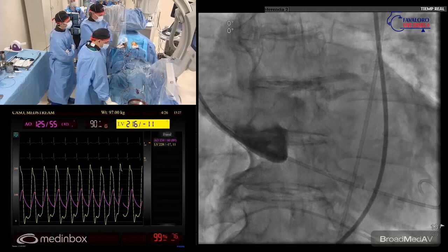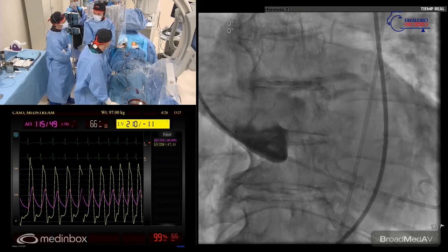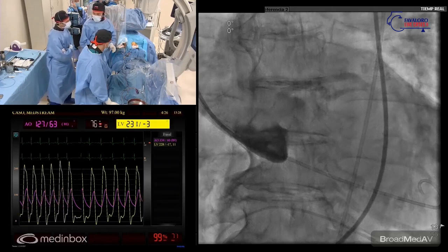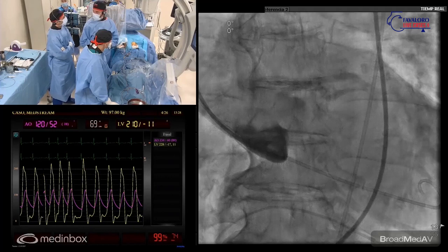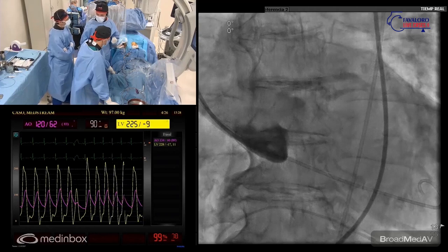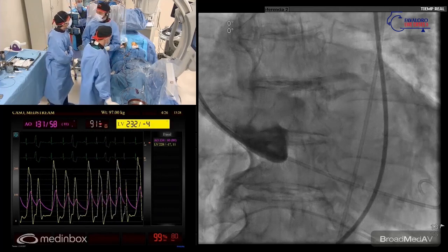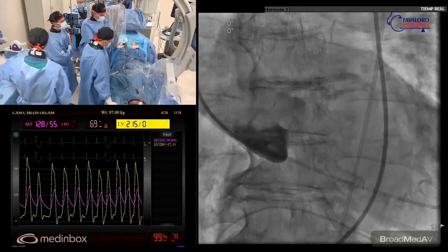We have started to use one single ProGlide, but in combination with the Angio-Seal. What we usually do in these cases is to close the first ProGlide over the wire with a 6 or 5 French introducer set. So if everything is almost okay, we introduce the Angio-Seal, we pull the Angio-Seal completely, tighten the knot or the thread of the ProGlide, and then we close the Angio-Seal. Interesting. So a combination of both. I learned in Europe from my friend Marko Noc in Slovenia. Okay, good. As always, we learn from each other.